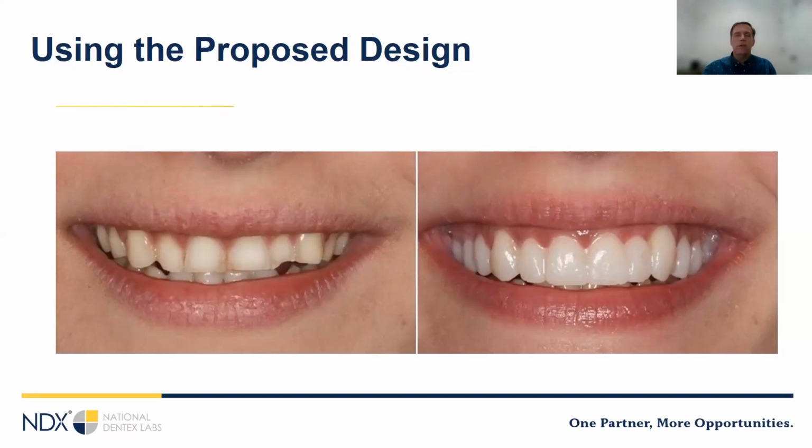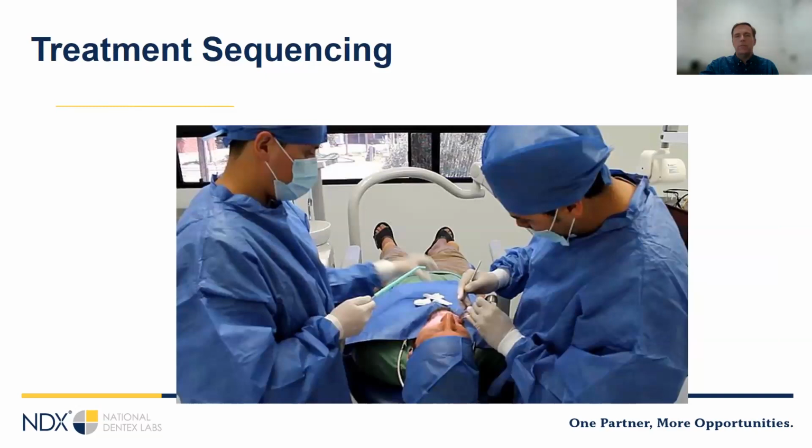It's a lot easier to get in there with a needle bur and just open up the contact a little bit for flossing. As you can see with this person, since we were adding incisal length and buccal position, we were able to put some bonded restorations on there so that she could see, okay, this is where my teeth are going to be. And the nice thing is if you bond those on, you can just prep right through the PMMA when you're ready to prepare the case.